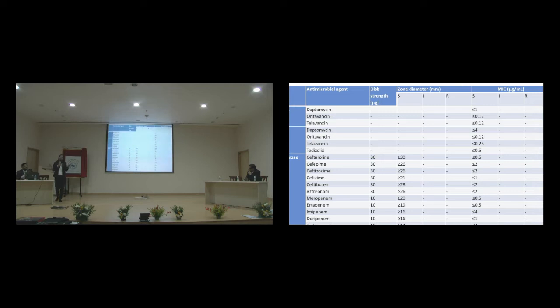Why is this? Because resistance mechanism is almost absent or extremely rare. That is why repeat testing is recommended. Still you get the same result, you have to refer it to a reference center. That is the meaning of non-susceptible. Is it clear now? So truly speaking, not susceptible is what it literally means. But non-susceptible has been updated to a kind of proper noun status right now. So it's a defined terminology. So don't use non-susceptible casually, but you can use not susceptible in a casual way.